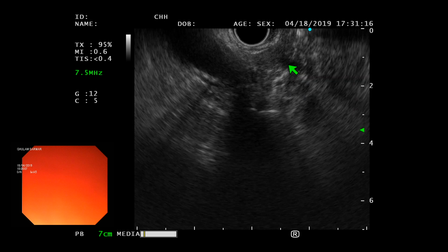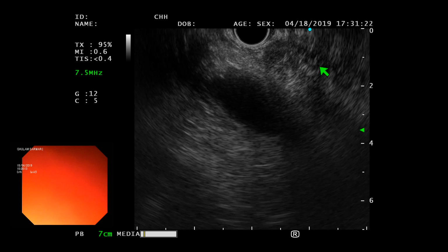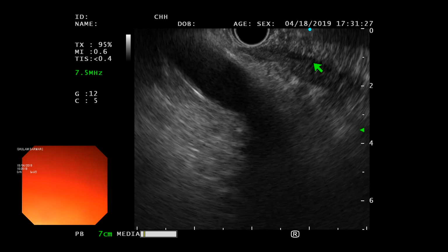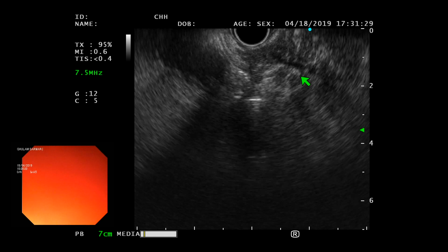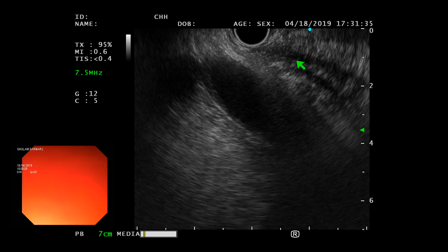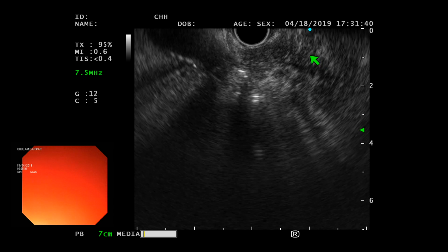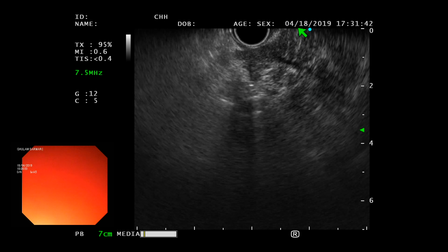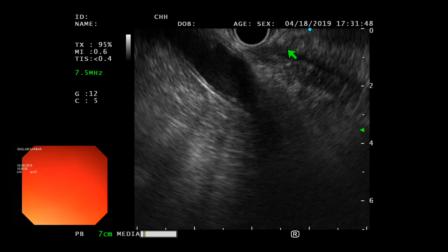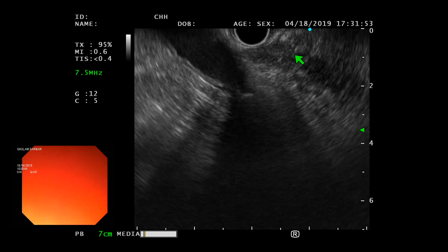Khalid, there's a query from the audience that had it been a pancreas divisum, what would have been the picture? Okay, let me finish this, and then I'll show you how it would go. If it was really a pancreas divisum, you see that better sometimes from D1. But in that case, you see a bile duct here. You won't see this pancreatic duct here. You will see that pancreatic duct crossing the bile duct and opening above the bile duct, so not underneath the bile duct. The bile duct is opening here. Pancreatic duct is underneath that. Can you appreciate that? Yes, we can appreciate.